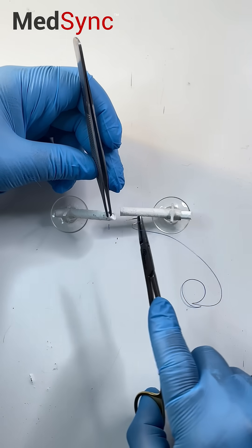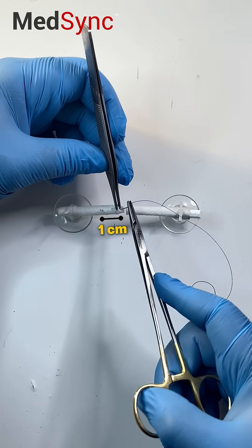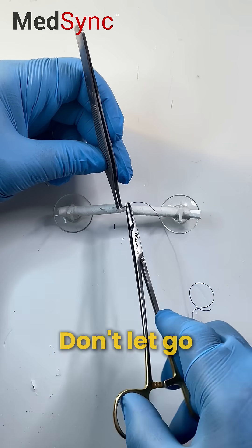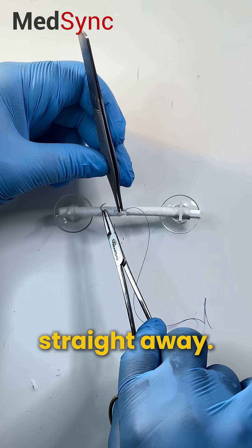Keep a hold of the tendon and take a one centimeter bite exiting from the site of division. Don't let go of the tendon — mount the needle straight away.